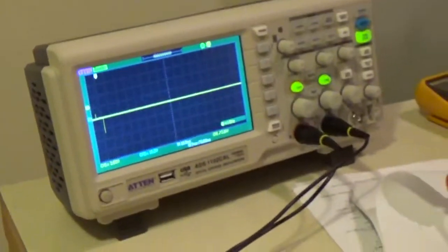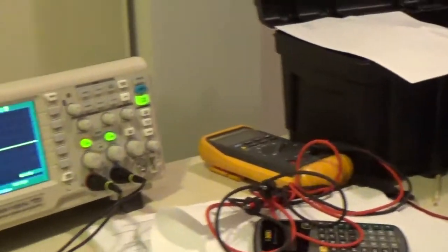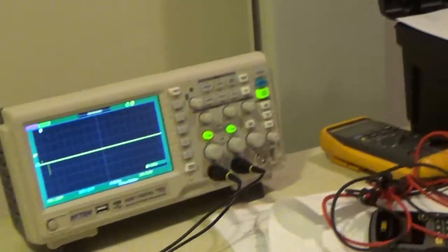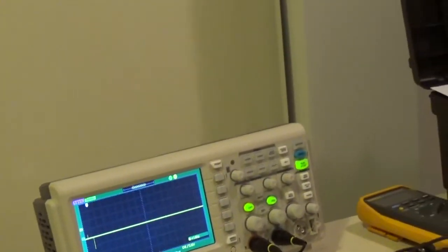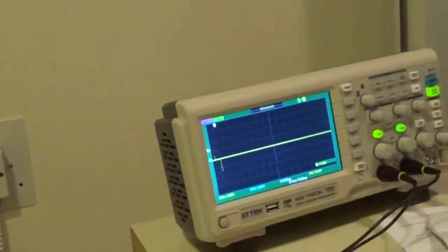So when you're selecting 80 kV, you're really not selecting 80 kV. You're selecting 40 kV on 2 different windings, and the windings are opposite. Because you're just getting the top. Right. So the difference between the positive going 40 and negative going 40 with reference to ground is 80 kV peak to peak. That's what kVp stands for, kV peak to peak.